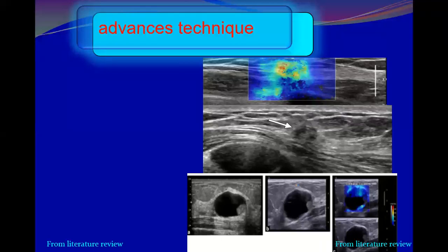That means this blue color here represents soft tissue, even the surrounding tissue is soft. It totally represents soft. Yes, soft. So the nodule is presenting a green color, I think, borderline. It is blue. It is soft.